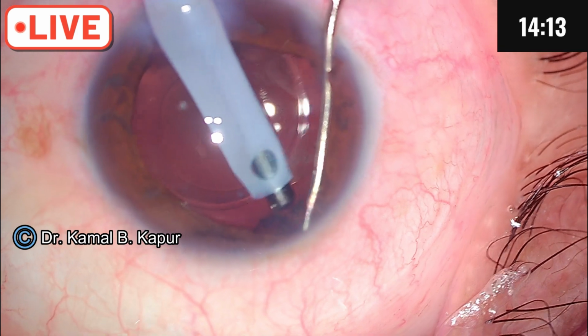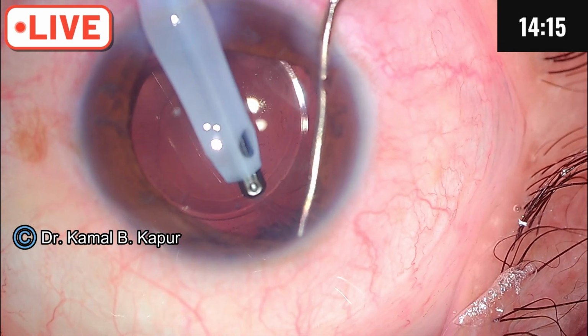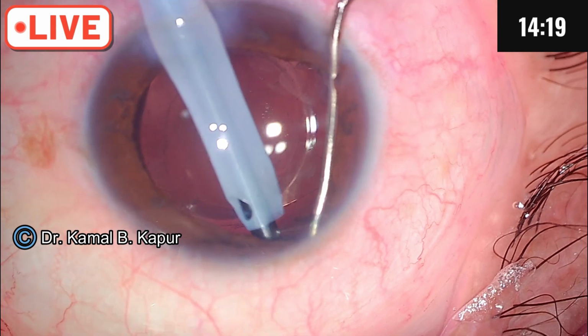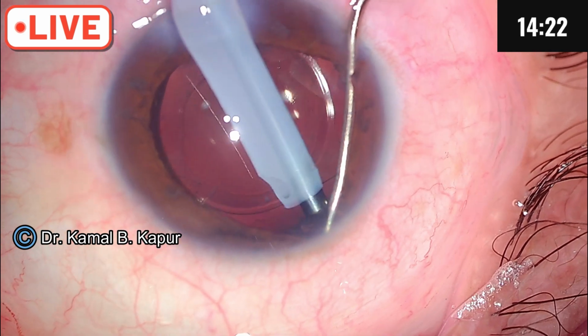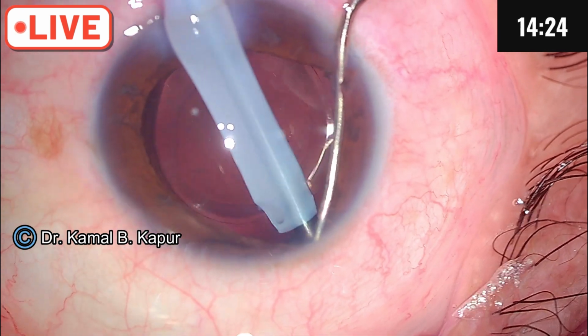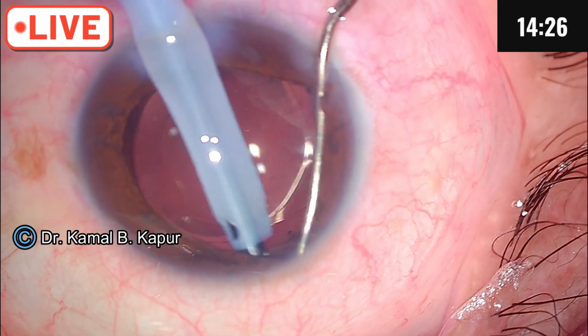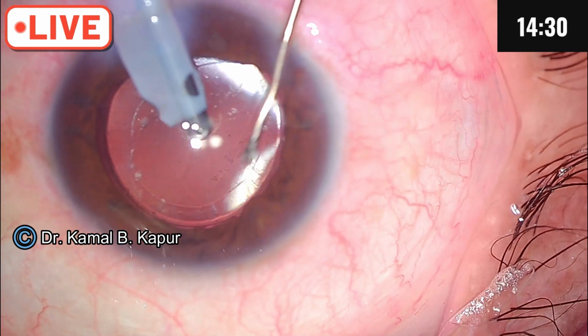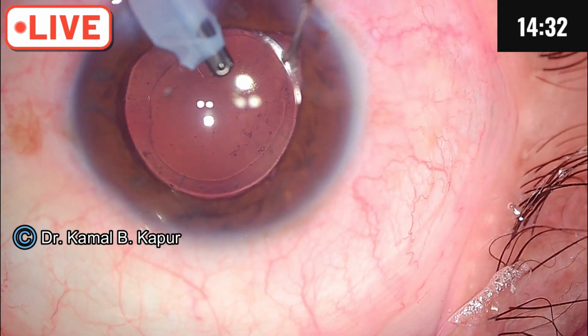I am able to peel some part of it, but that's a very risky proposition here. There, I've taken out a major big chunk of that.